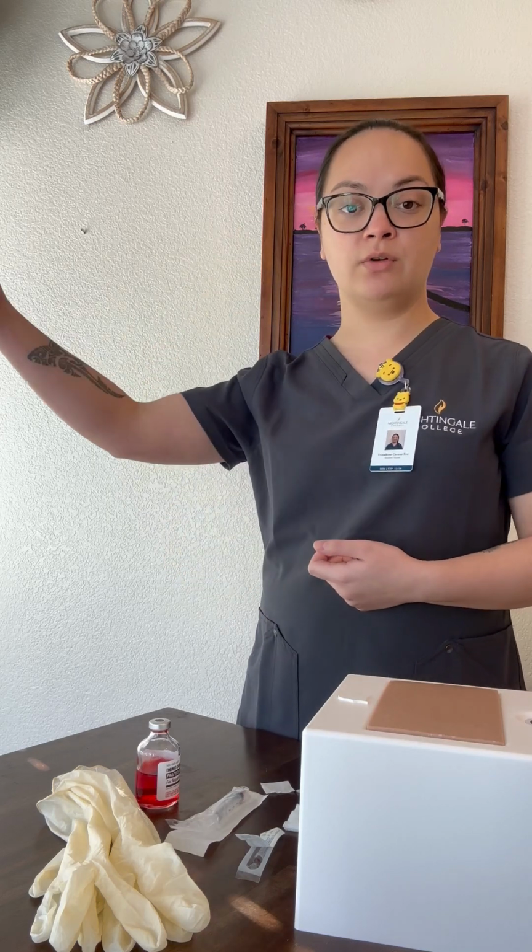I will go ahead and introduce myself to the patient. Hello, my name is Trina. I'll be your nurse today. Close curtain for patient privacy, hand hygiene. Can you please verify your full name and date of birth as I verify with the wristband? Thank you for that verification, Mr. Bob.